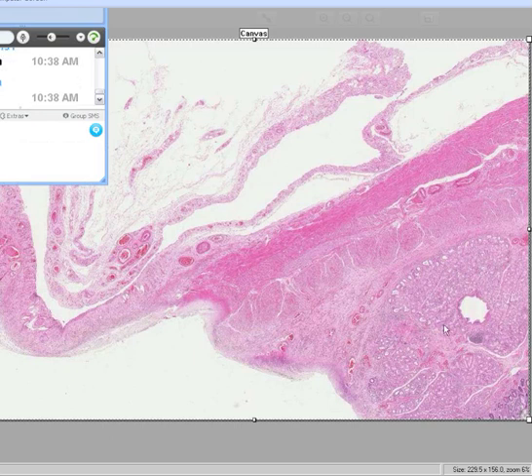So this is duodenum. You can see parts of the mucosa here in the extreme southeast. And then you see a lot of normal looking submucosal glands. Then you have your circular and longitudinal. And then you got a little connective tissue. And you know, 90% of the duodenum is retroperitoneal. So this is probably adventitia rather than serosa.